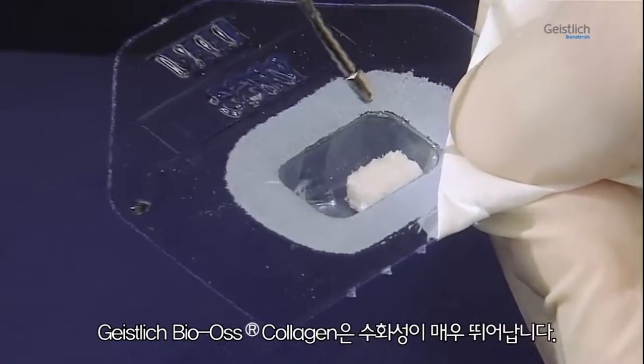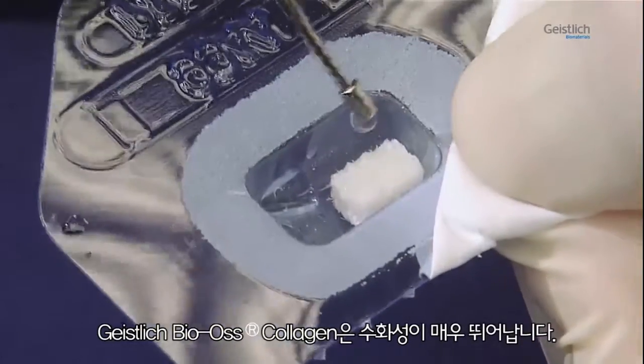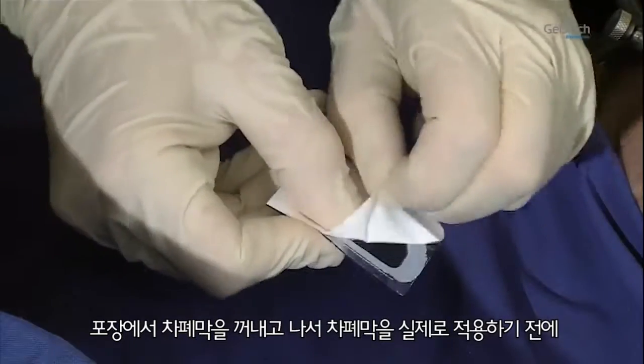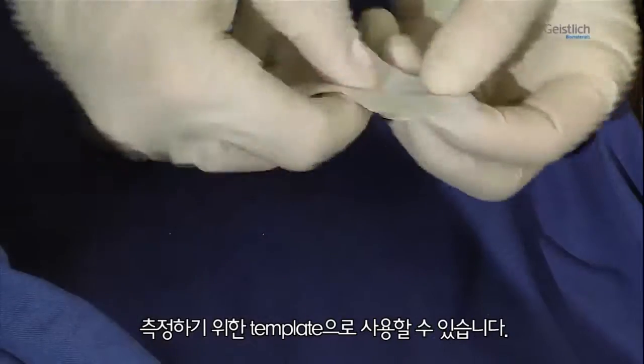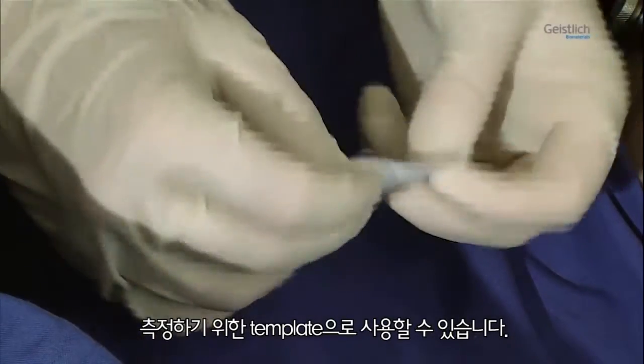The Geistlich BioOs collagen block absorbs liquids well. Once we have removed the membrane from its packaging, the paper of the blister pack can be used as a template to determine the proper size and shape for the membrane before working on the actual membrane.